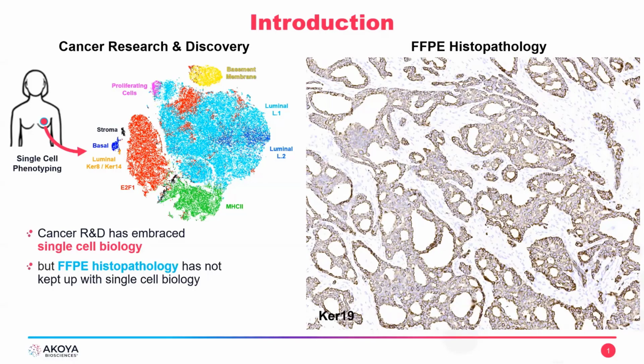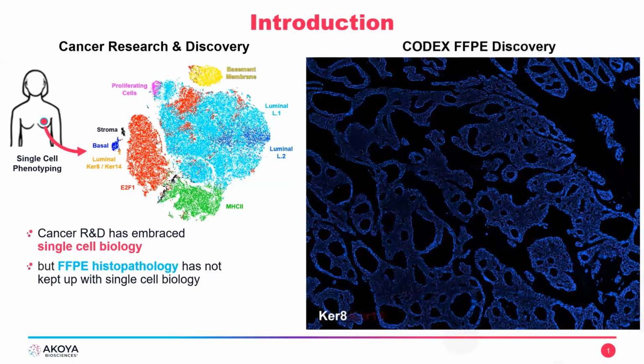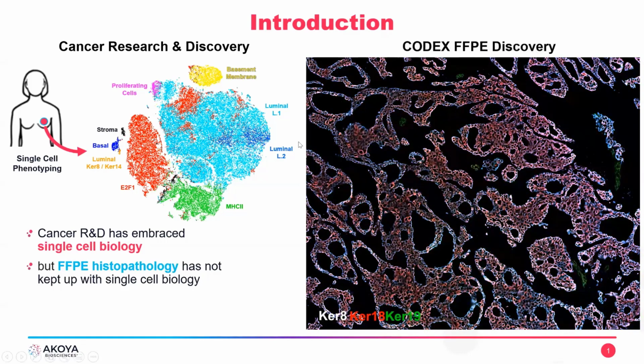This is a general problem, and people generally recognize that if we use fluorescence microscopy, we see more. What you can see here are the same three markers: keratin-8, which is blue in the image but white here for better visualization, keratin-18 in red, and keratin-19 in green. You can more readily see differences, especially small differences, between these different types of breast tissue epithelia. There's an epithelium that labels primarily with keratin-19. Here is one that may have more keratin-18 than keratin-8. On the flip side, this one has more blue, and thus keratin-8, than others.